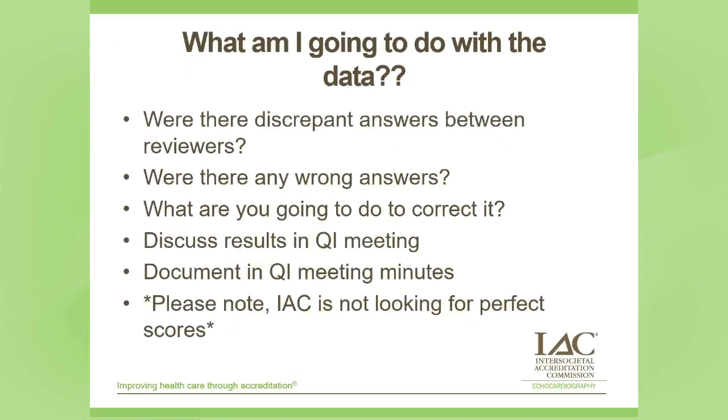So what am I going to do with this data? Were there discrepant answers between your reviewers? Well, yeah, we saw that in some of it. Were there any wrong answers? Well, then that's where the medical director probably needs to come in and review.